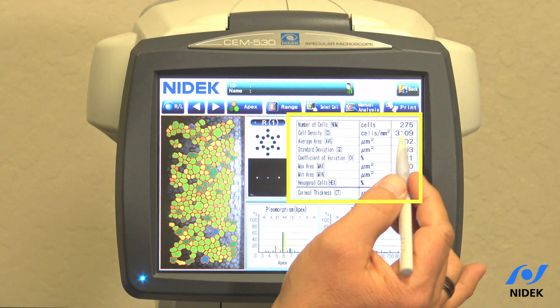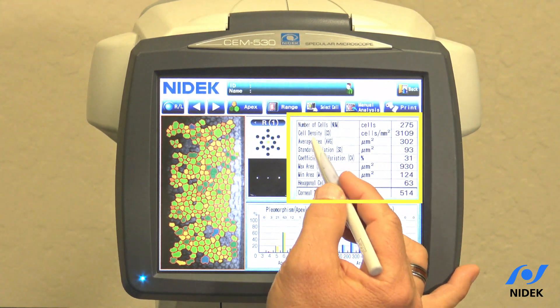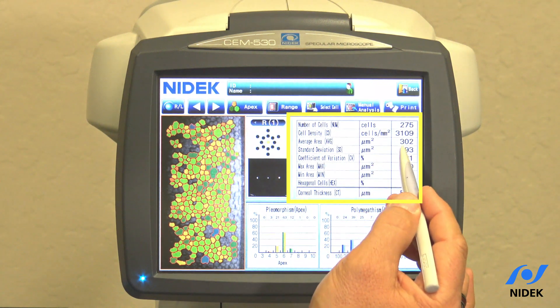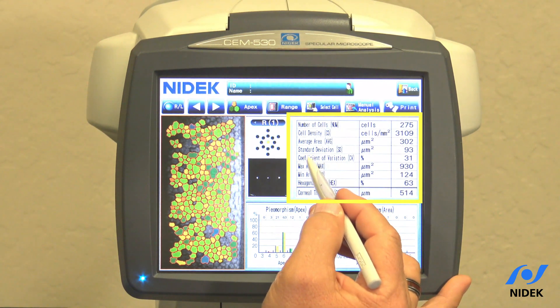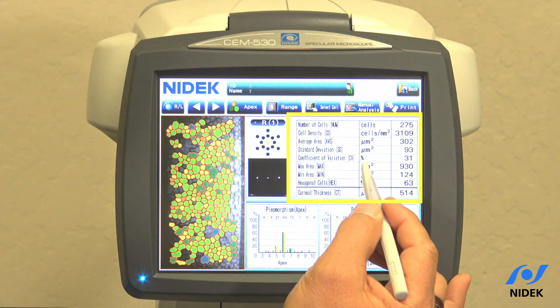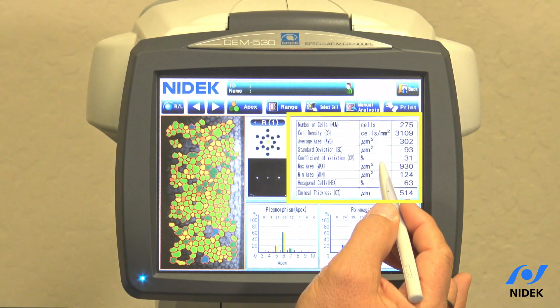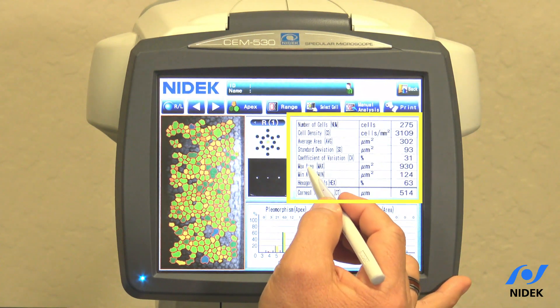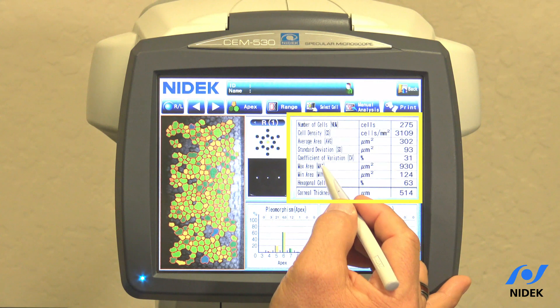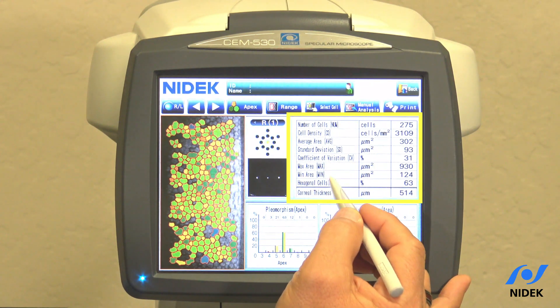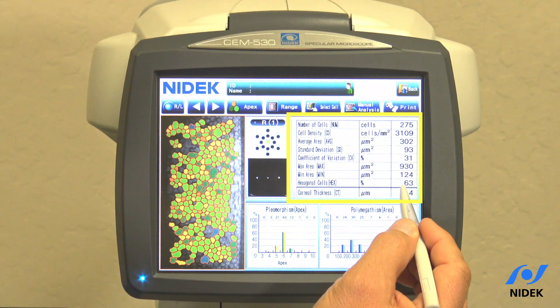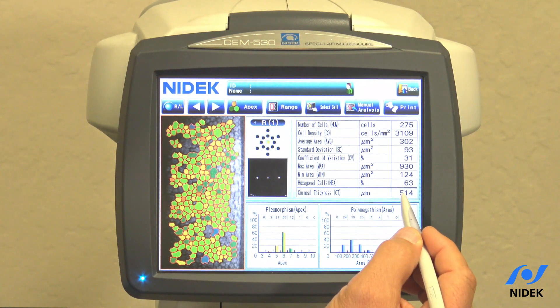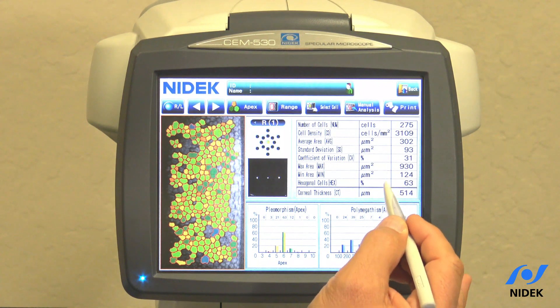In the analysis table, we can see the number of cells counted, the cell density, the average area of endothelium analyzed, the standard deviation of the analysis, and the coefficient of variation in percentage — which is the standard deviation divided by the calculated average. The max area is the largest area of endothelium analyzed, minimum area is the smallest, hexagonal cells percentage is the percentage of hexagonal cells, and then cornea thickness. Once analysis is complete, you can go into print and print the results.